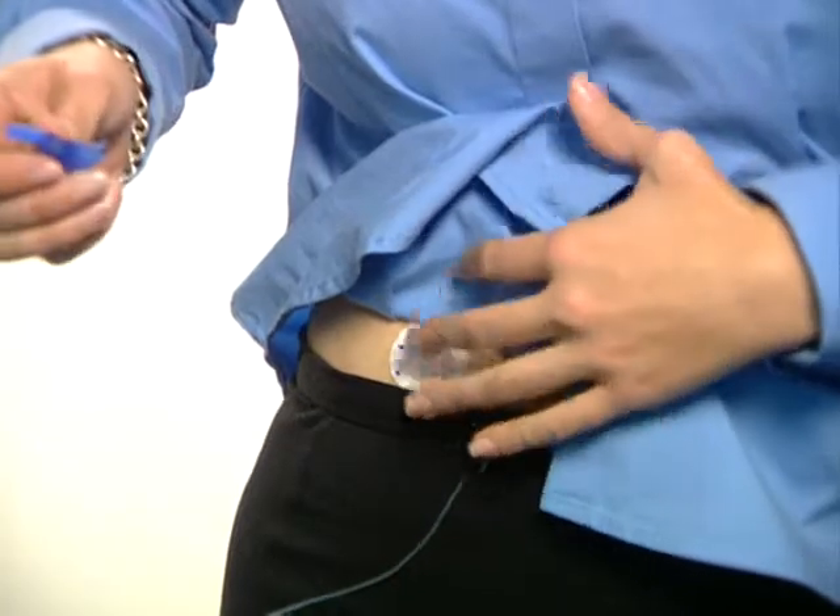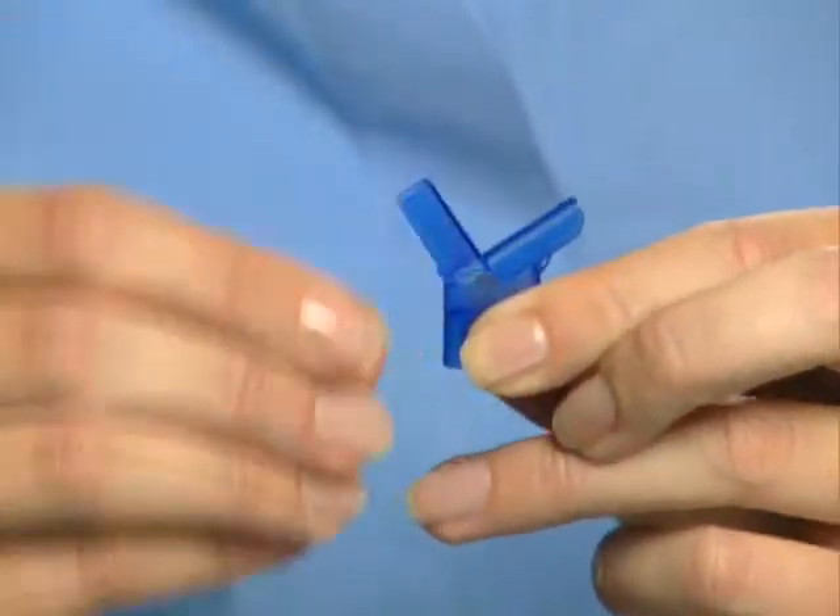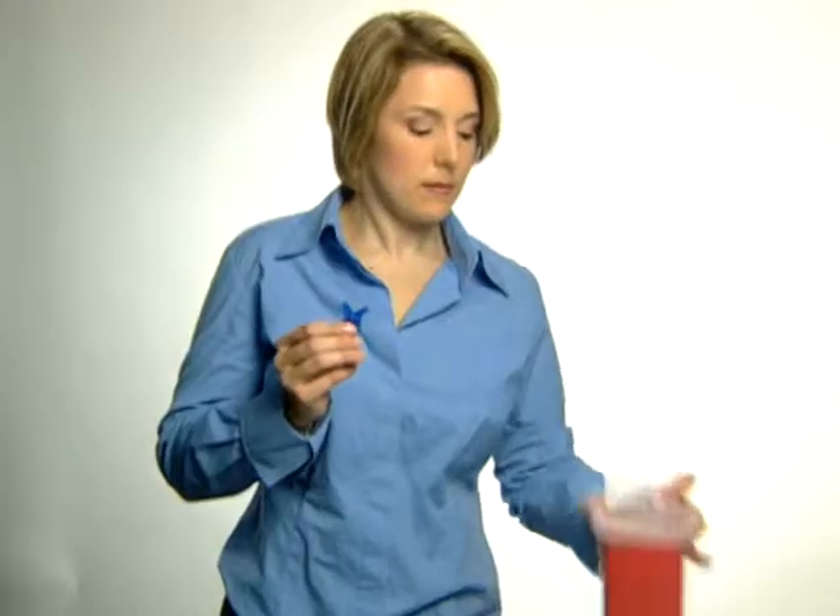To dispose of the introducer needle, fold the needle hub until it snaps into place. Then put it in a sharps container.